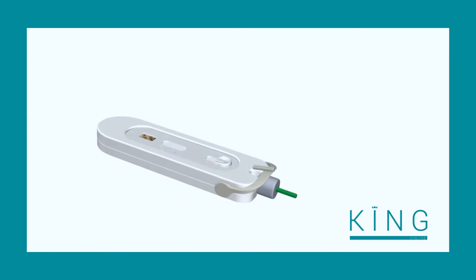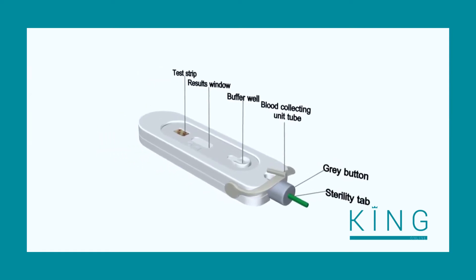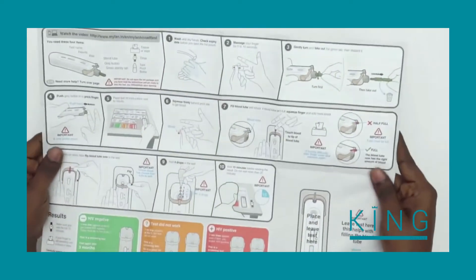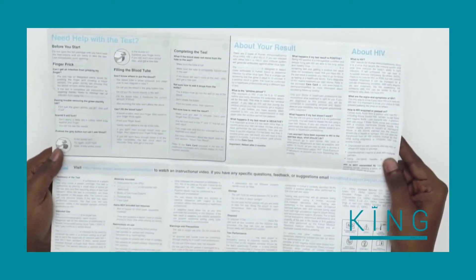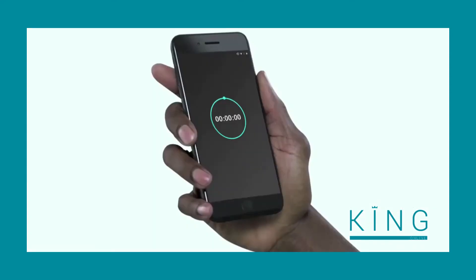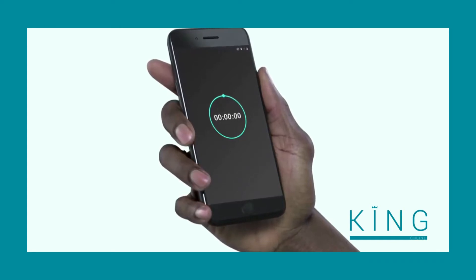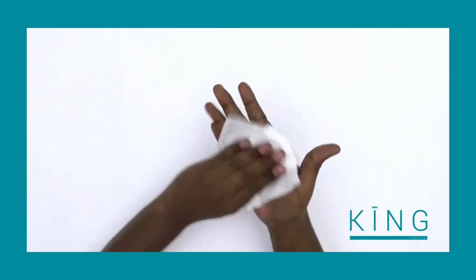The Mylan HIV Self-Test is an internationally acclaimed device known for its innovative design, performance, and ease of use. Before you start the test, unfold the instructions and read them carefully to get familiar with the testing process. You will need a timer to check the test results at the right time. Wash and dry your hands to make sure they are clean.